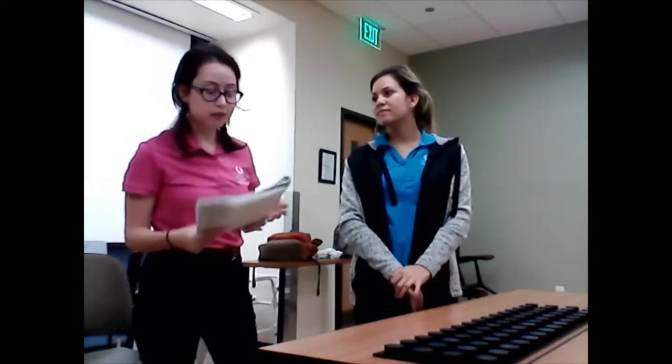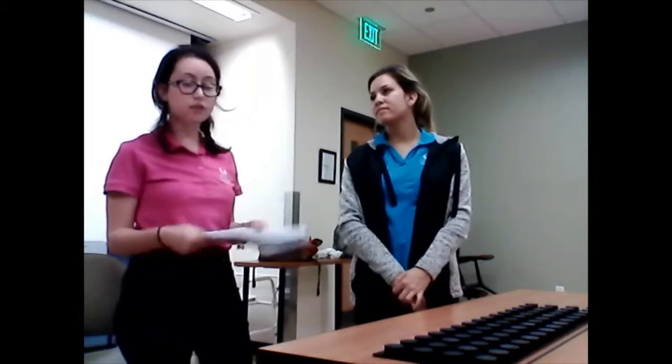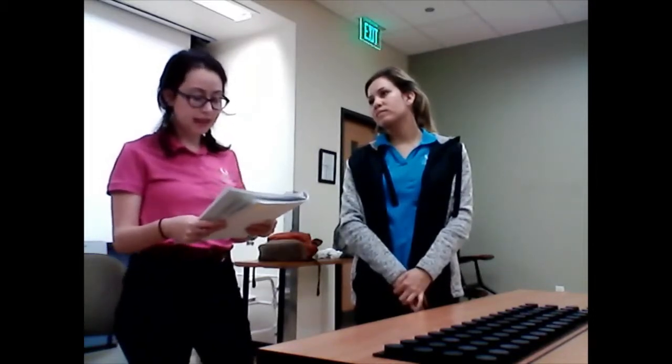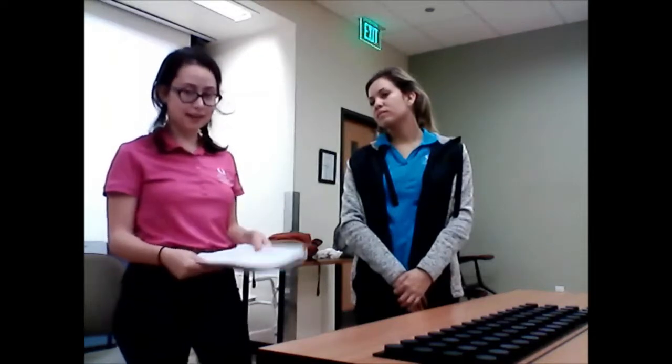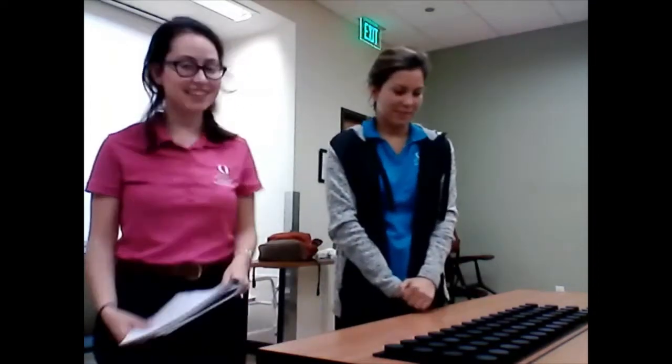In our assessment, there's going to be 4 different tests with 2 trials each: the placing test, the turning test, the displacing test, and the one-hand turning and placing test. Are you ready, Nicole? I'm ready. All right, we're going to start off with the placing test.